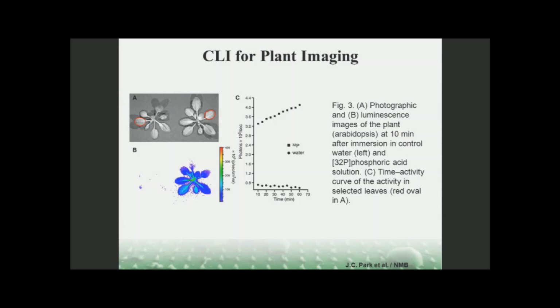You can use Cerenkov luminescence imaging to measure radiochemical purity. Before, when you tried to measure radiochemical purity, you usually needed to run the TLC, put it into the TLC scanner, then cut the TLC piece by piece, count the radioactivity of each piece and do the calculation. But now with Cerenkov luminescence technology, you simply put the TLC plate into the optical imager, and then you can do the calculation. That's very convenient and was demonstrated by this Korean group before.